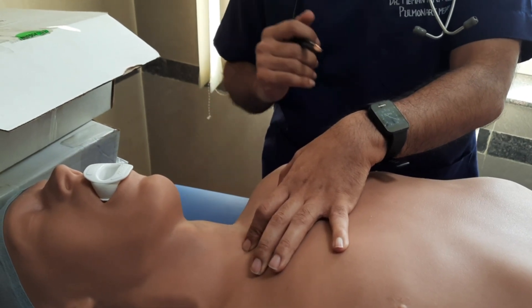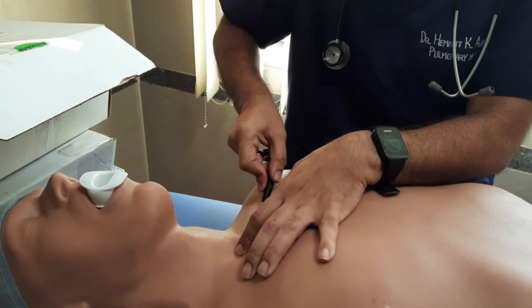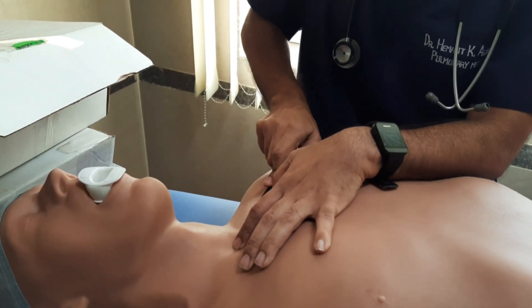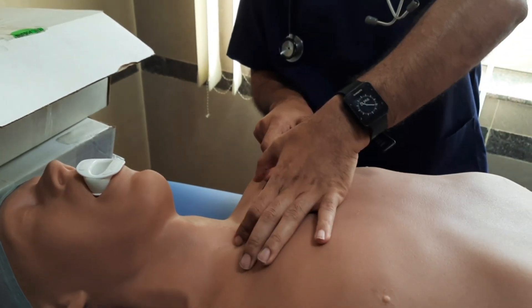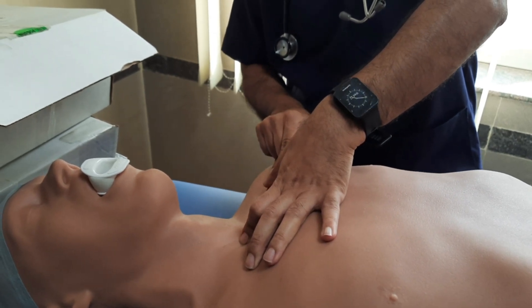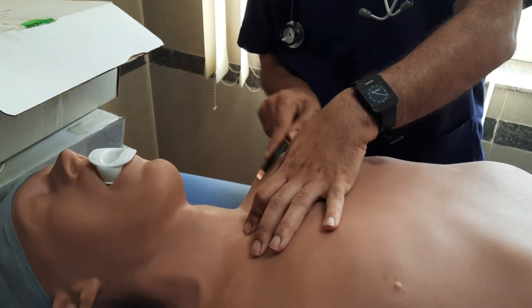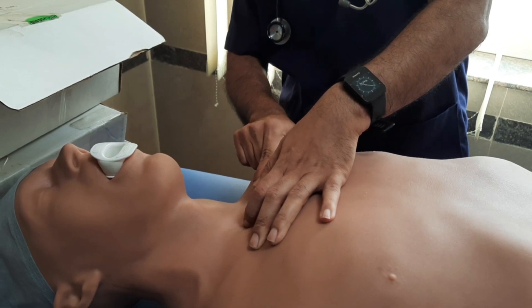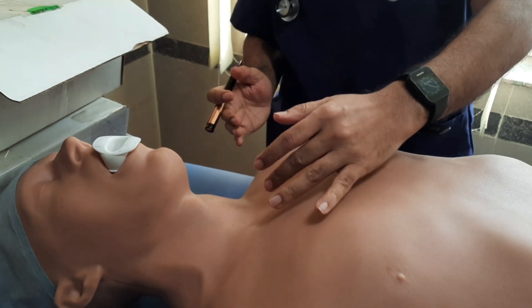We will keep one finger in the supra-sternal notch and the thumb on the insertion site. We will take the needle and insert it at a 30-degree angle. Just after insertion, direct the needle toward the finger on the supra-sternal notch. Once we hit the clavicle, press with the thumb, keep direction toward the supra-sternal notch, and go parallel only — otherwise we will create pneumothorax.